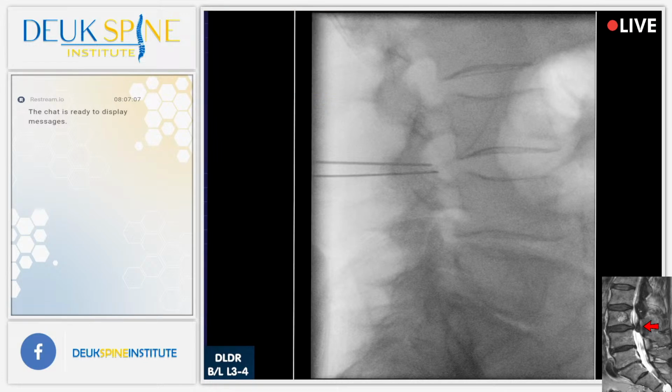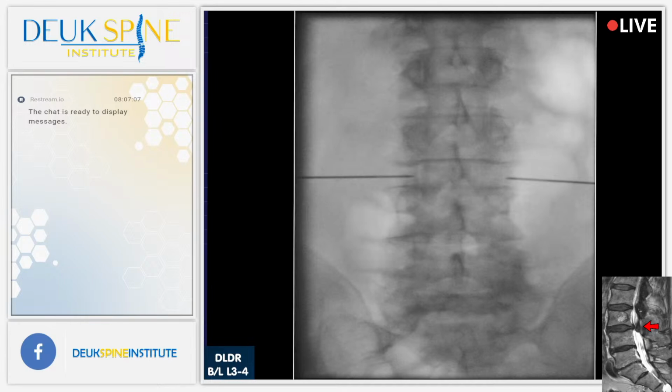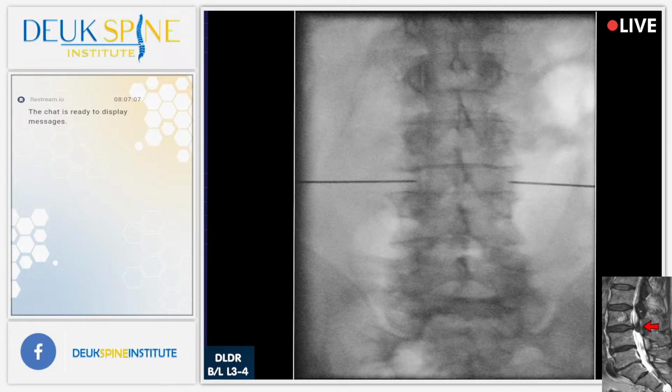So before I go any further and get closer to where the nerve could be, and I'm not talking about the L3 nerve, I'm talking about the L4 nerve at this point. That looks really good. All right.